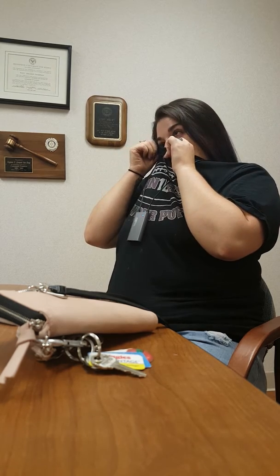I can hear her! Yeah, pretty cool, huh? You hear me now? Yeah! Plug up your right ear. What'd you have for breakfast this morning? Breakfast? Cheerios. Good. You can take your finger out now. Are you gonna start crying? No, I'd be okay. But it's a pretty cool moment. It is — it's a cool moment. I might start crying. Stop! You are gonna start crying, it's okay, she loves you. I've been known to cry sometimes. Hearing my own voice talk is weird. Thank you, thank you.